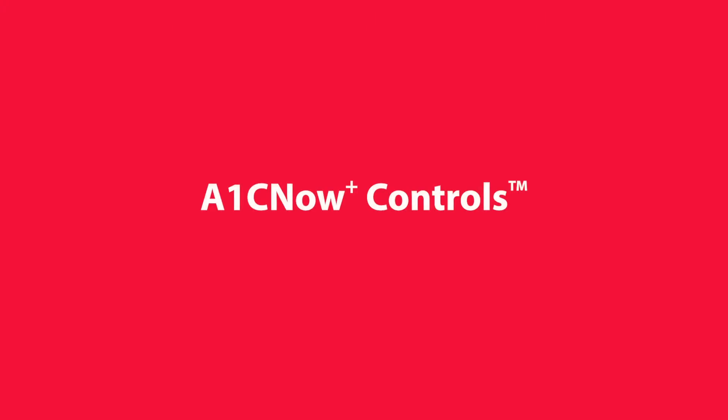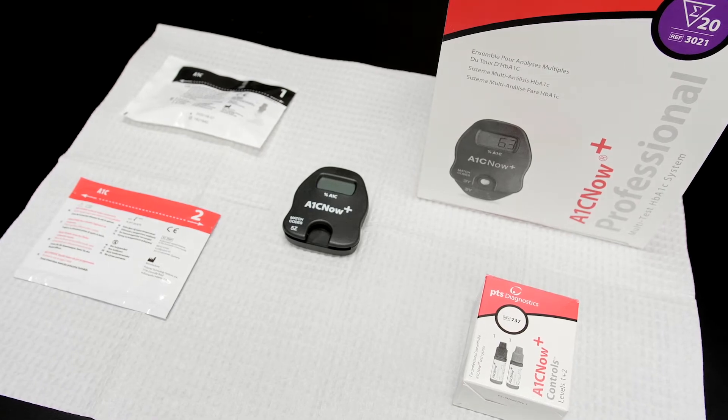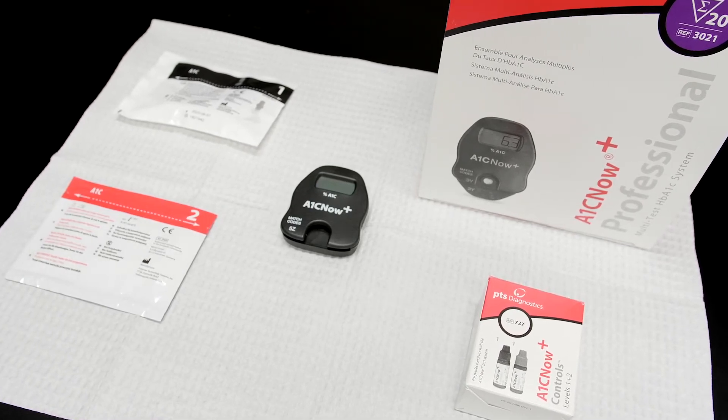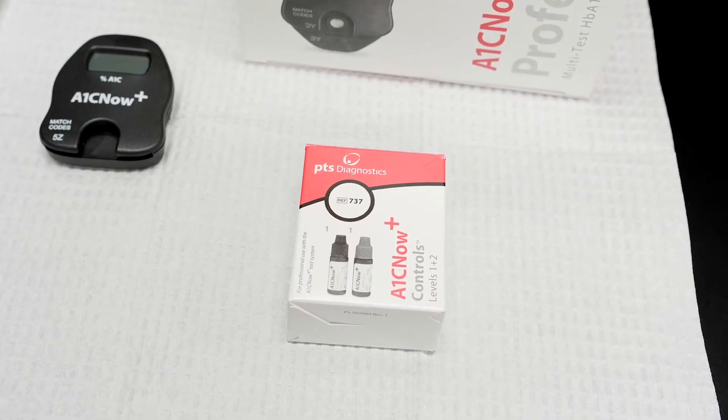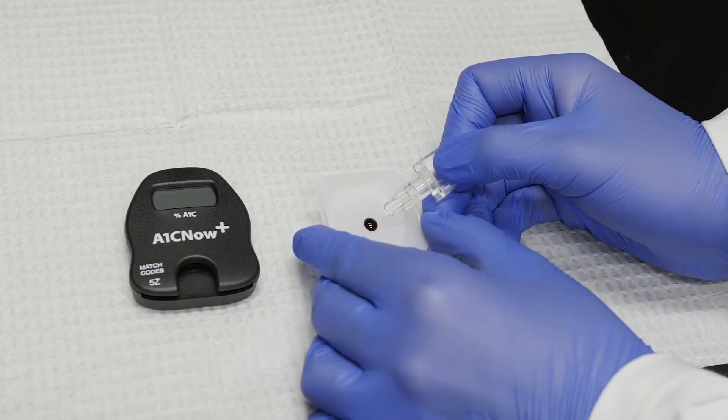A1C Now Plus Controls. Running quality control materials helps to verify the performance of the test. In this short video, we will show you the steps to run A1C Now Plus controls for your A1C Now Plus test system.